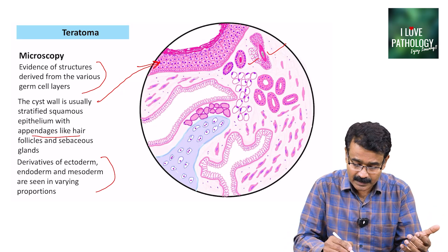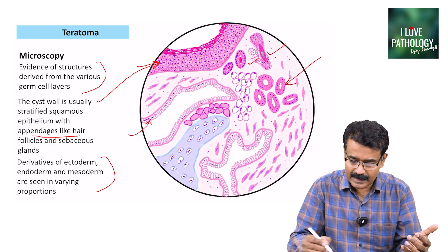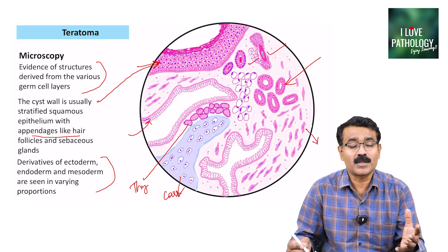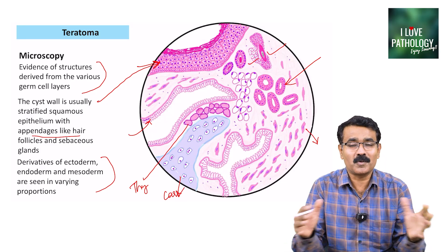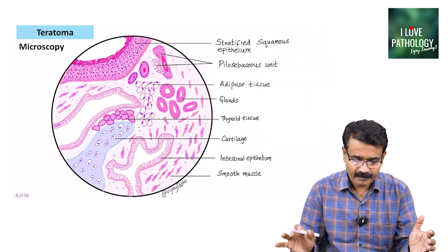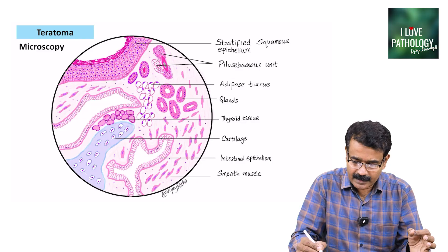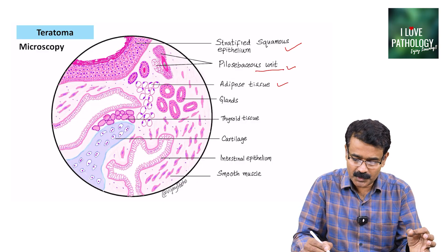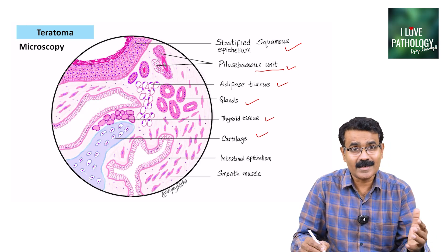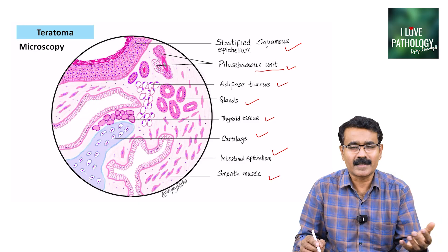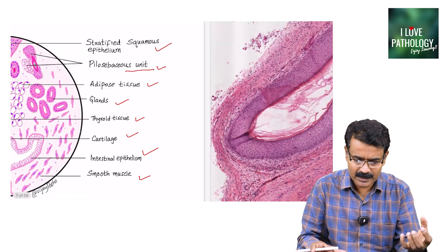In the illustration, you can see glands, thyroid follicular epithelial cells, cartilage, and smooth muscle — basically almost all kinds of cells in a mature teratoma. So that is the stratified squamous epithelium with the pilosebaceous unit. You also have adipose tissue, glands, thyroid tissue, cartilage, intestinal epithelium, and smooth muscle.